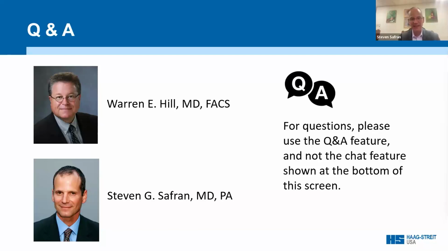I have a two-tiered practice. Some of my patients come in from all over for complex cases; they fly in, I see them, and we do the surgery the next day. So we can't take too much time on those patients, sort of one and done. But I have my own local patients, and very often we'll do exactly what Warren says, tune them up. Sometimes we have to scrape them, get rid of the anterior basement membrane dystrophy, do a superficial keratectomy, and just wait for things to heal.